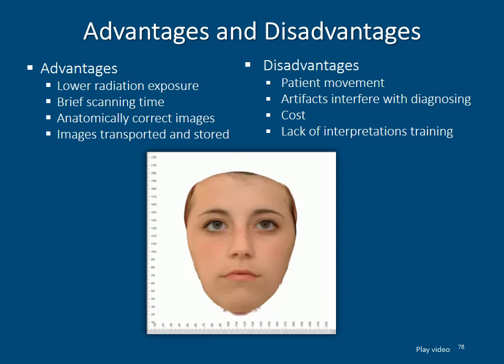I'd like to take a moment and let you see this little video. It shows the progression of how these CT cone beams relate to actual facial representation.